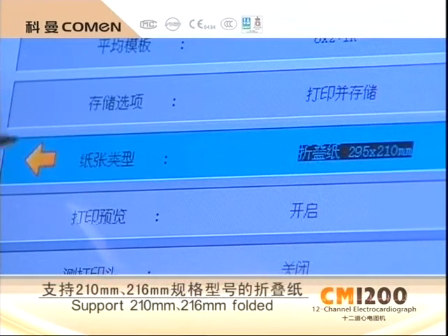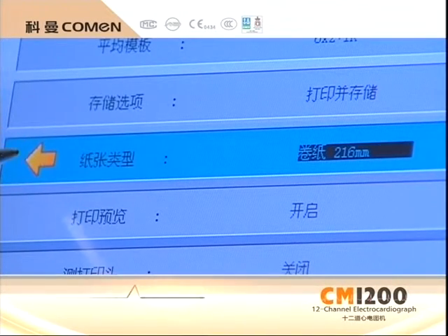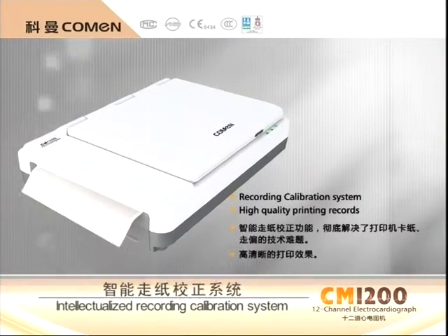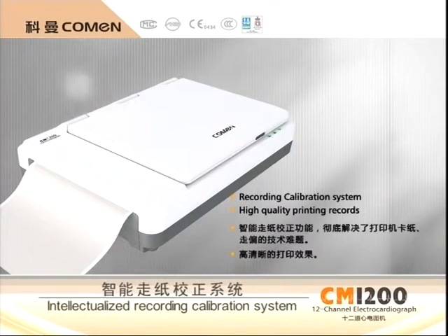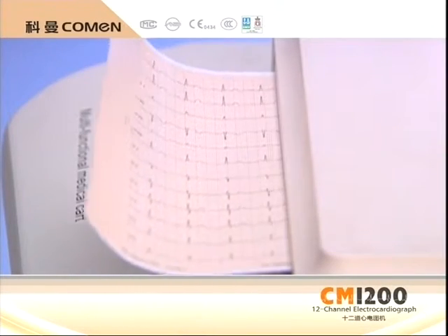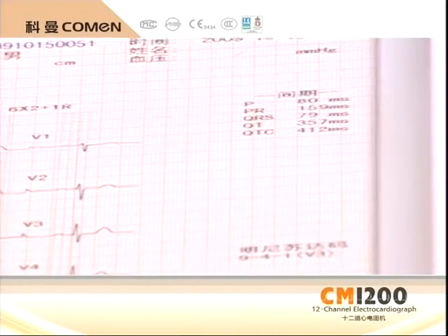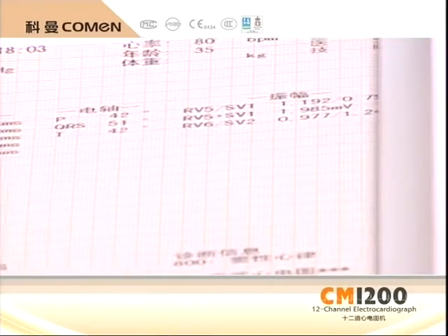The CM1200 is compatible with recording paper of various specifications, enjoying rich recording formats. The original intellectual paper feed corrective function serves as a thorough solution for technical problems of paper jam and dislocation in the printer. Due to its quality printing effect, CM1200 is widely used all over the world.